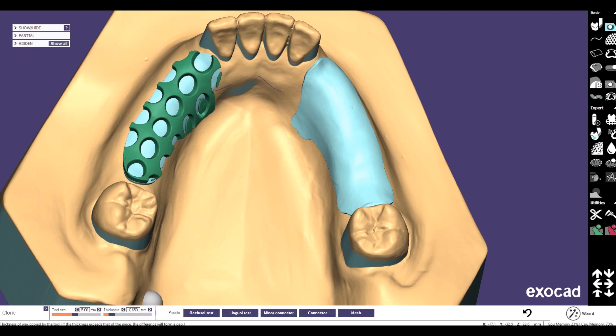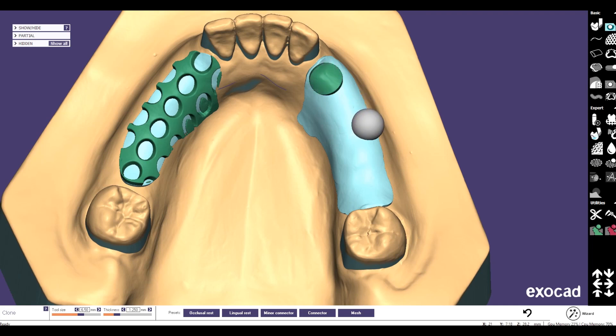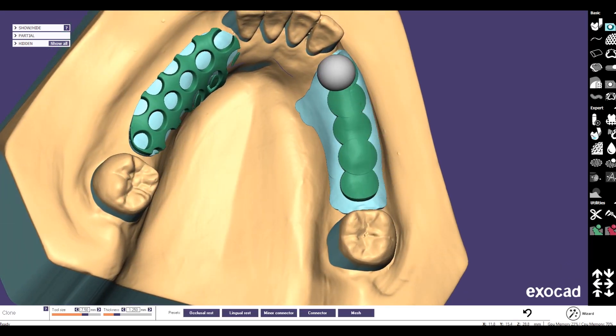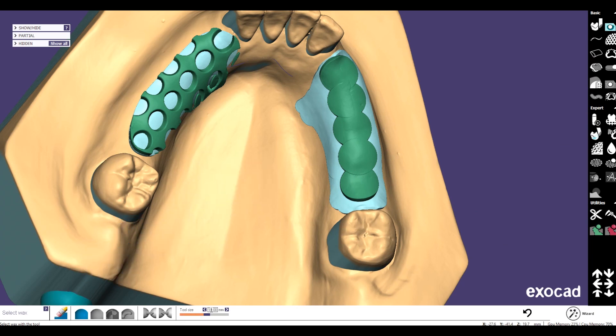Now we switch again to the clone wax tool. For the thickness, similar to the other side, I would select one point two five, and the tool size round about six point five — I think six point five would be fine. We make holes — this is too small — we choose six point seven, okay, that's much better. Now we place the retention ball as we would in the classical way, so you can see these will be the rings.